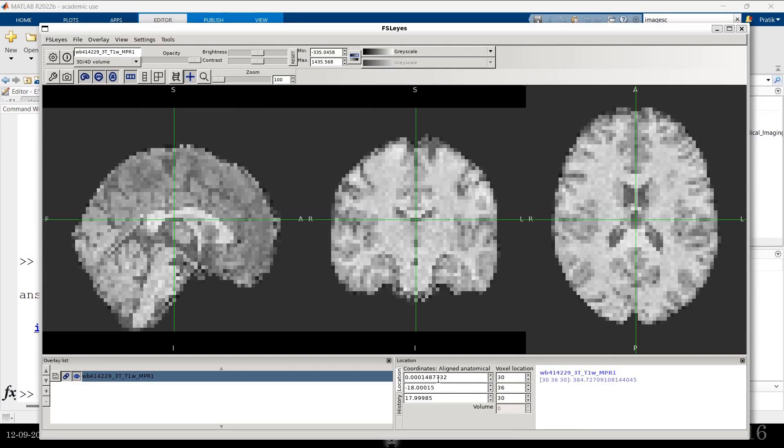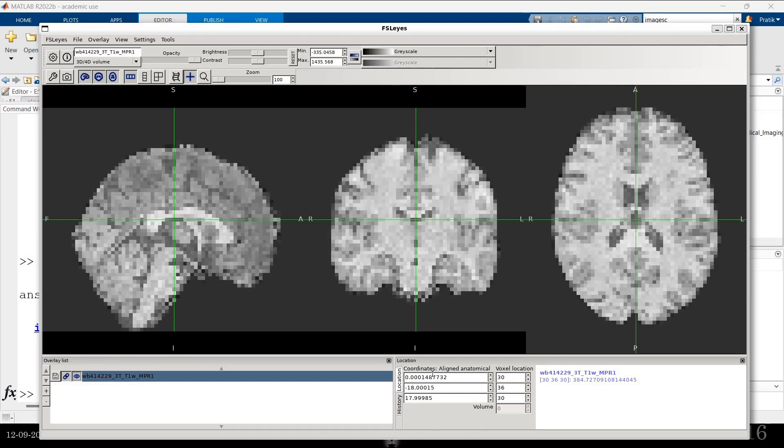But there is something else as well. There is this which is the MNI coordinates. Or this is the space that I was talking about earlier. It's the MNI space on which it's a standard space where all the brain is mapped.